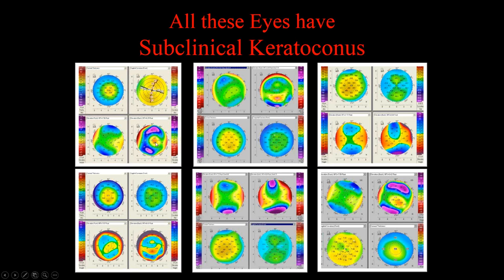Here again, you'll notice a posterior ectasia. You'll notice a very normal looking astigmatic surface. Here, I think this is the same example I just showed you before, a big posterior ectasia, a normal anterior surface. Here, you actually have astigmatic patterns on both the anterior and posterior surface, but it's really the pachymetric map that is abnormal. The thinnest point is significantly displaced here.